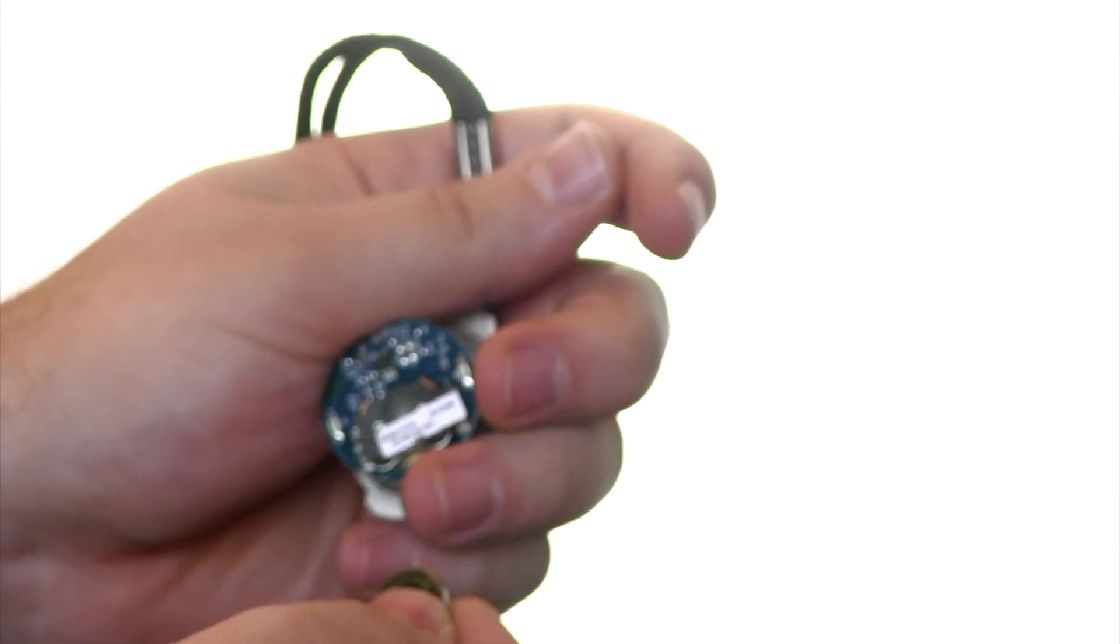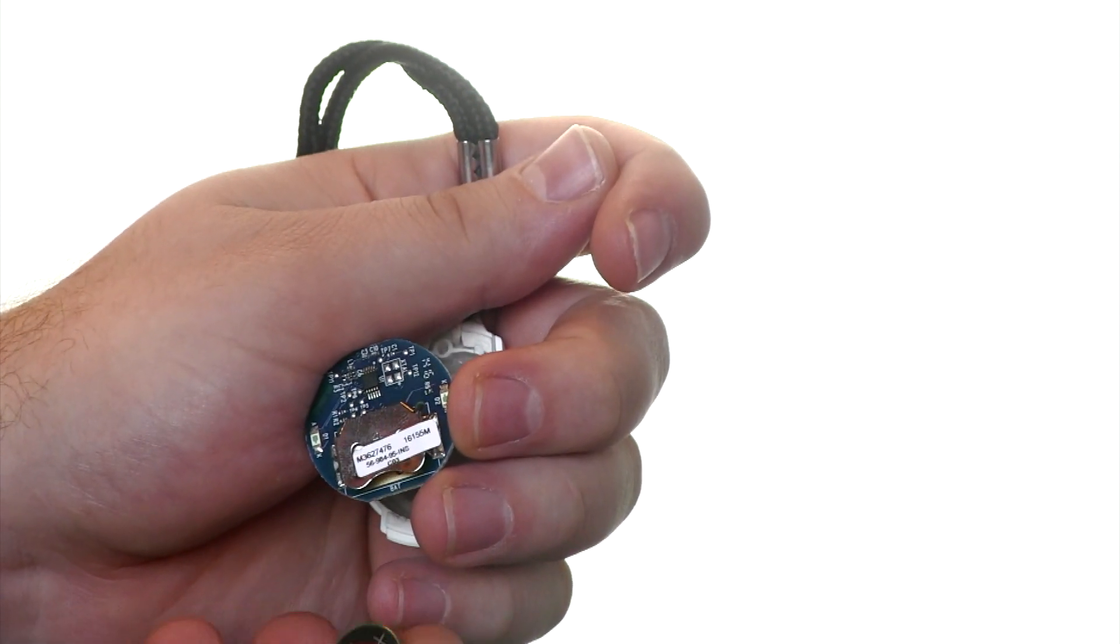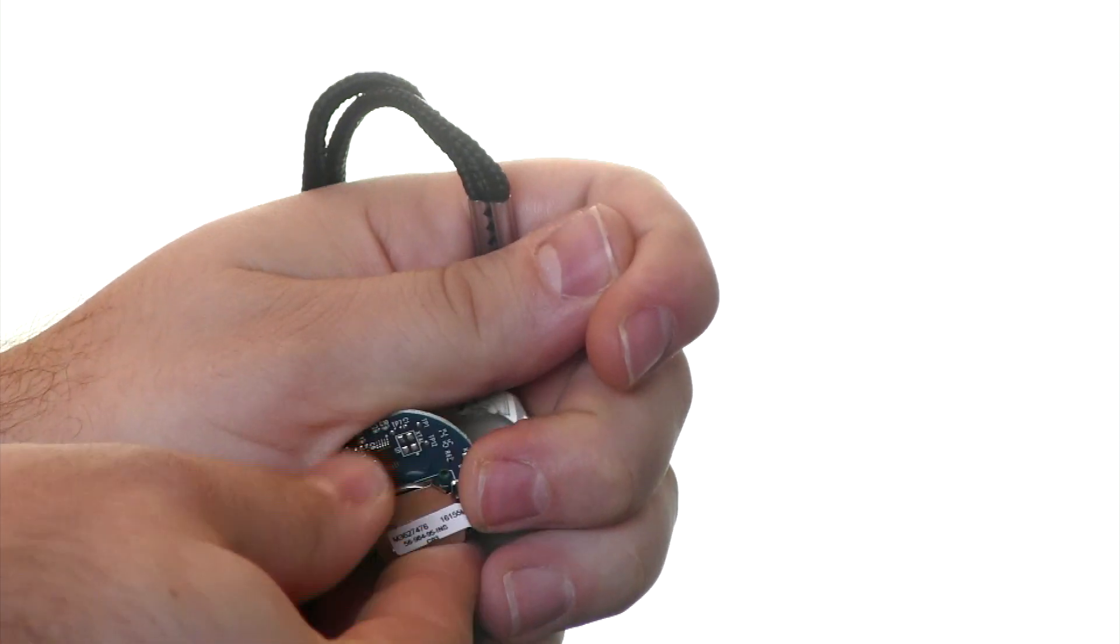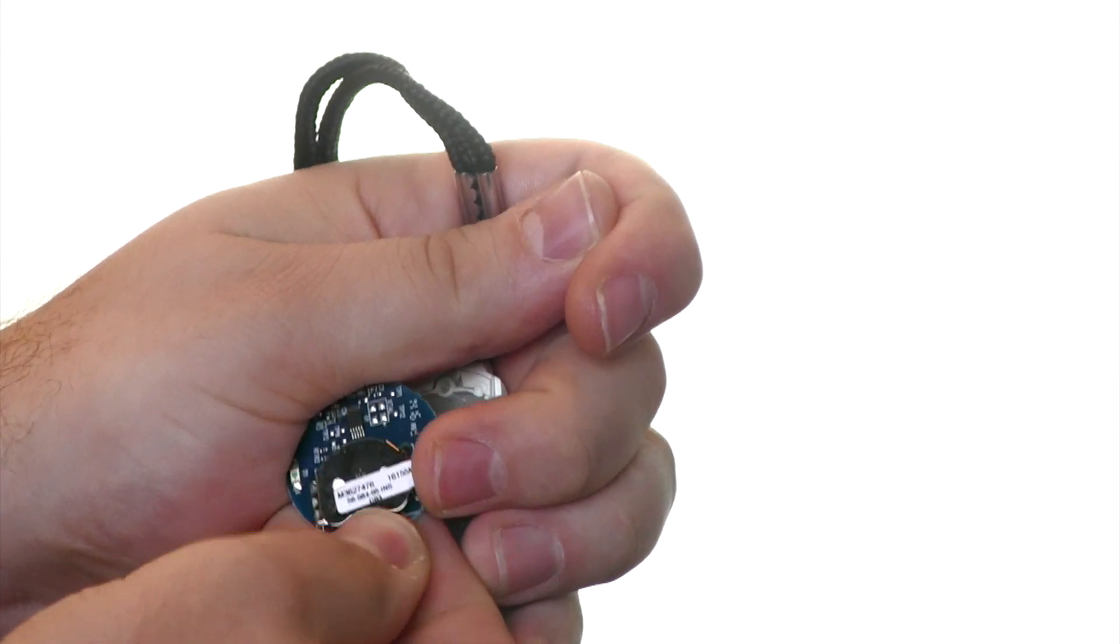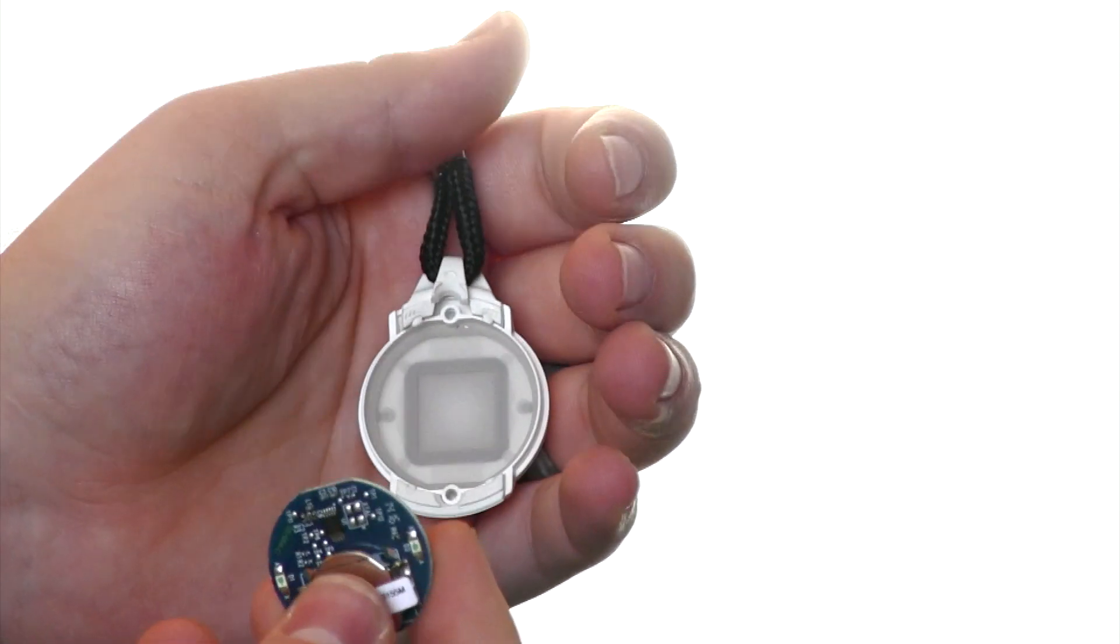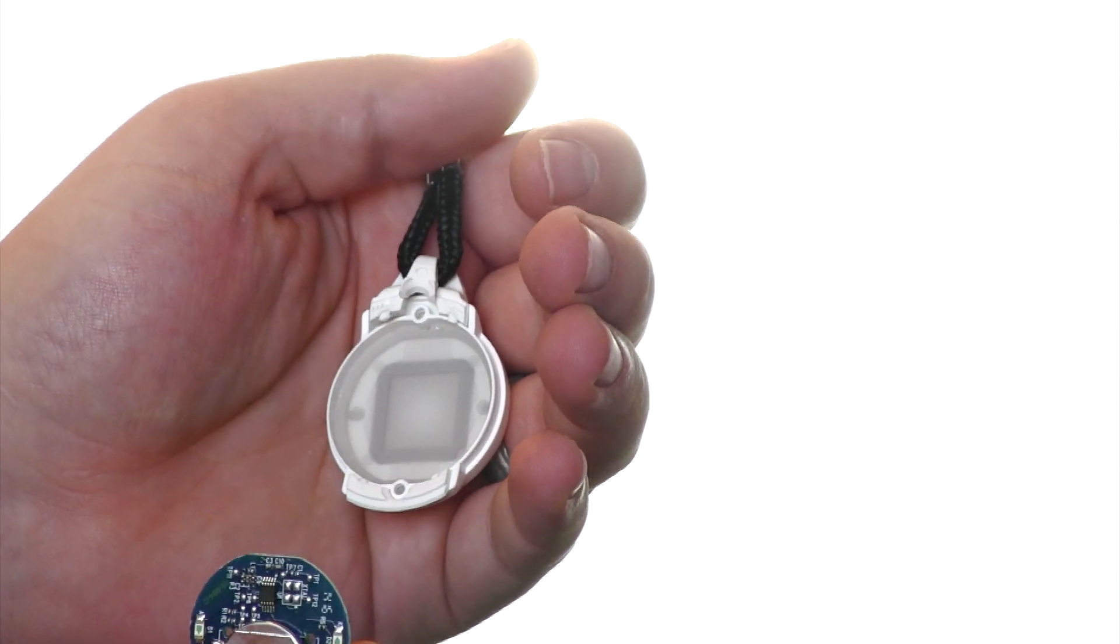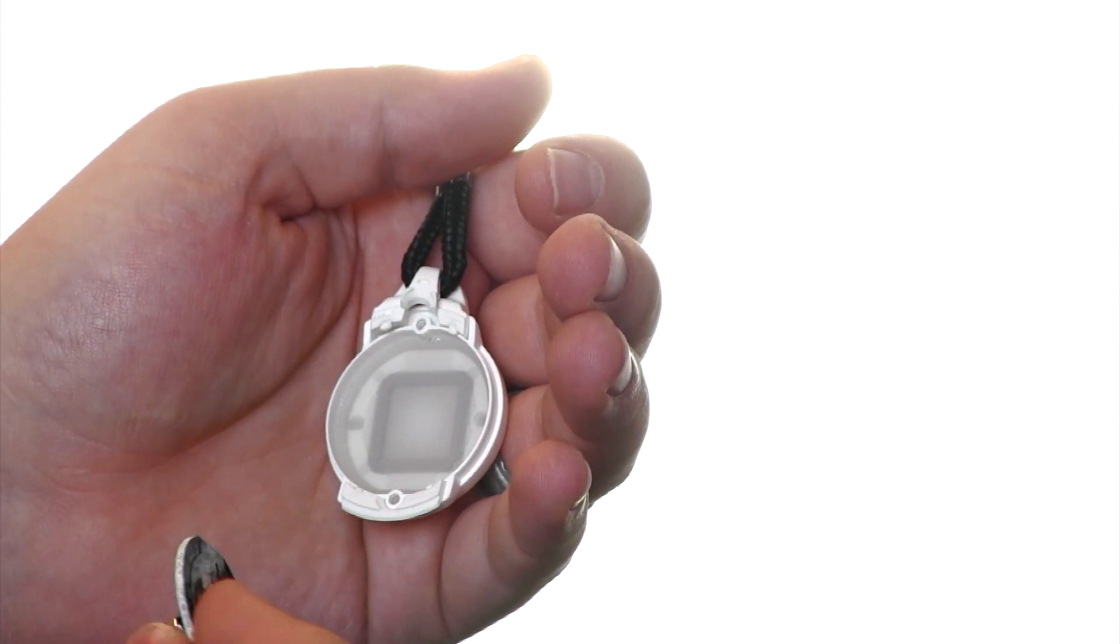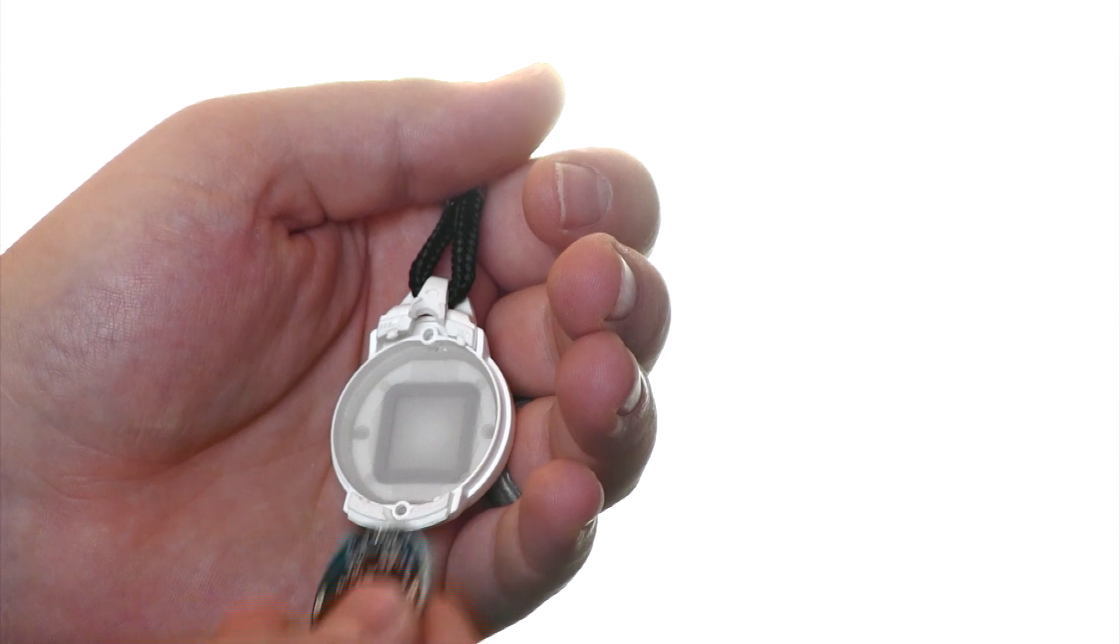Once you have the new battery, we want to make sure we slide it in with the lettering facing up. And then when we put the device back into the housing, we want to make sure that the battery is facing towards us so that the button can be pressed.